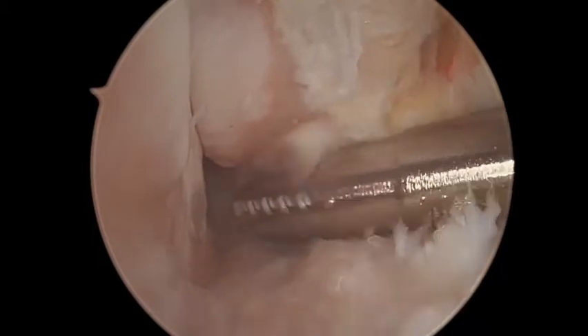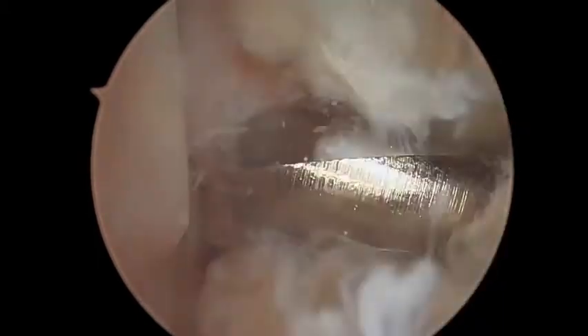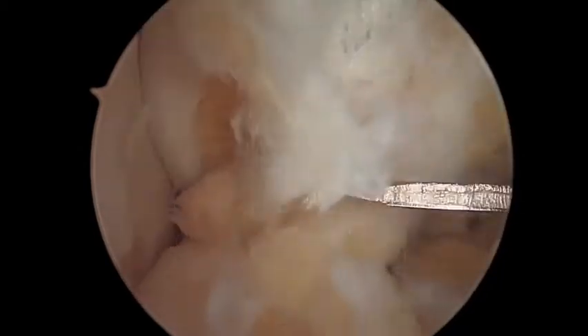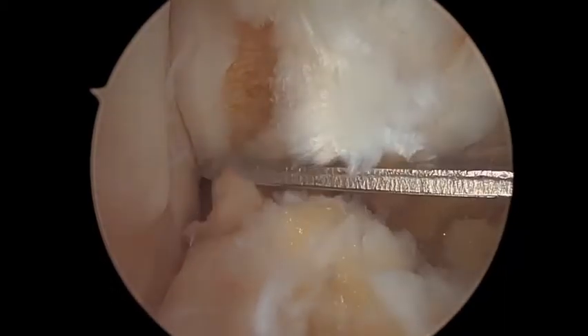The lateral gutter is inspected using the anteromedial portal. Scar tissue causing impingement is then resected with a soft tissue shaver, and the ATFL footprint is burred with a bone shaver to improve biological healing. A capsulotomy between the ATFL and the capsule is then performed.